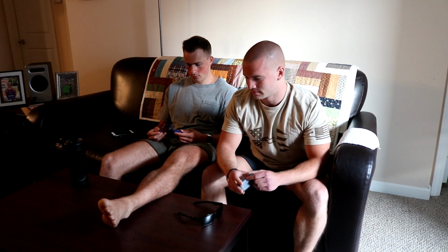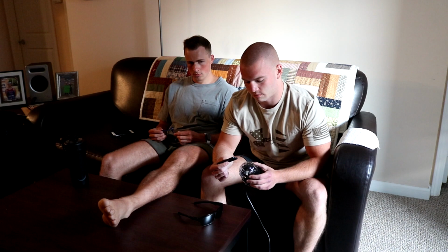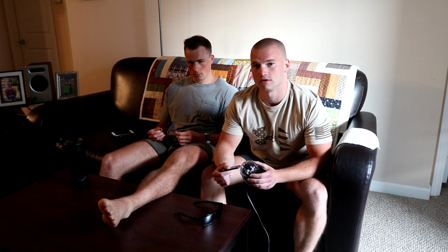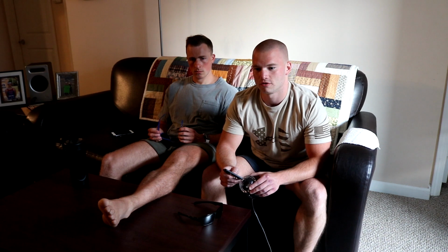So some general parameters for light therapy. These probe heads come with LED, SLD, or laser light bulbs or diodes in them. So depending on the depth of the tissue that you're targeting, you can use LED for more superficial or diffuse areas, SLD somewhere in between from superficial to moderately deep, and then laser penetrates the deepest, but it's also the most concentrated.